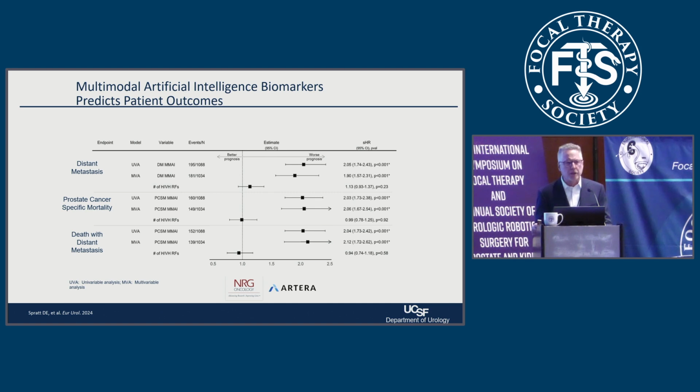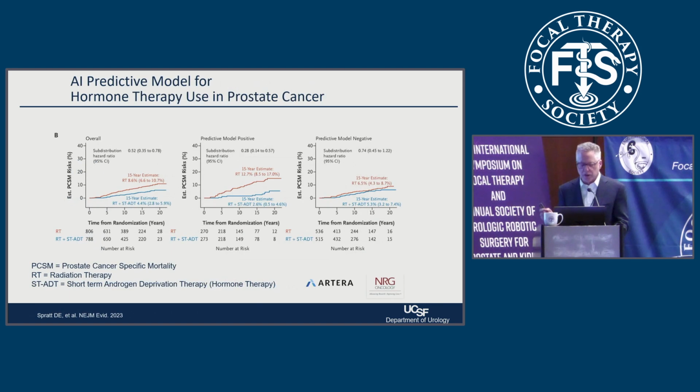And they developed an algorithm which predicts response to hormonal therapy, and actually this is in NCCN guidelines right now. It was included in NCCN guidelines very rapidly. And you can see that if you have a low score, there's no difference between using hormonal therapy or not, but in fact, if you had higher scores, there was. So for some reason, this is not available in California or New York. I don't know the reasons for that, but I think it's a very useful tool.